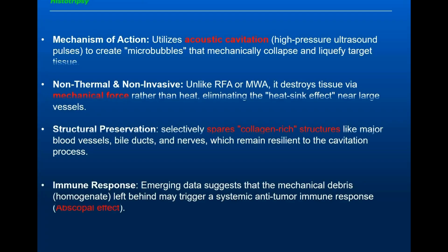Histotripsy is something, as I mentioned, I just added this slide yesterday just to make sure you have every updated information about what's going on. This is basically an ablation modality that's using the acoustic cavitation. As we mentioned before, the bubbles, when they rupture and they kill the tissue, this is basically what is happening. This is non-thermal, and it's very important, guys, to understand the difference. This is non-thermal. There is no heating here. It just destroys the tissue from the rupture of the bubbles.